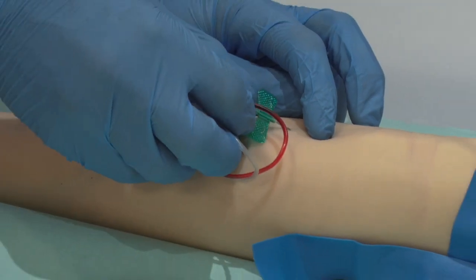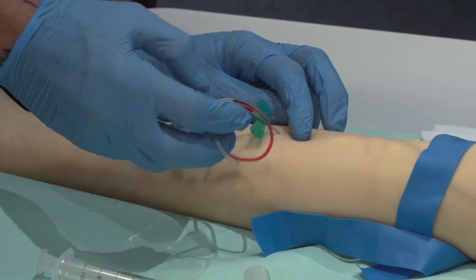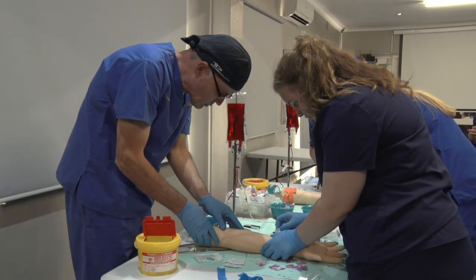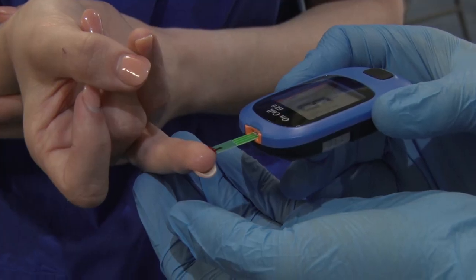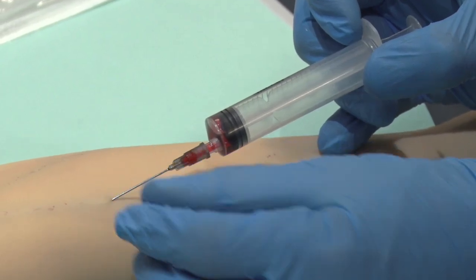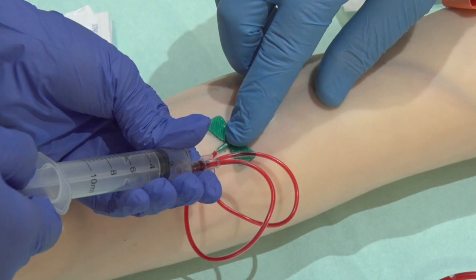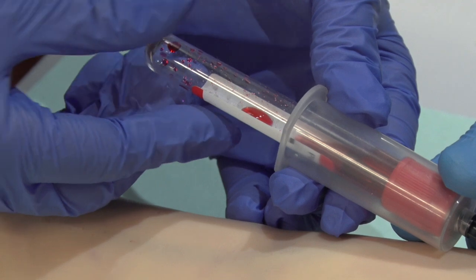Injection techniques will be practiced using suitable simulation skin pads or mannequins. Attendees will be mentored in blood collection techniques, including collecting capillary blood and collecting venous blood using the following methods: drawing blood with a syringe and needle, with a butterfly needle, and with a hub and vacuum tube.